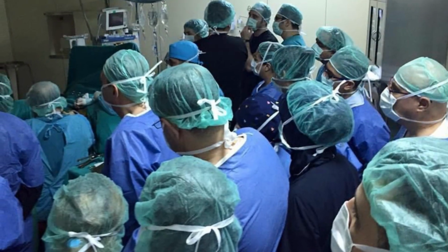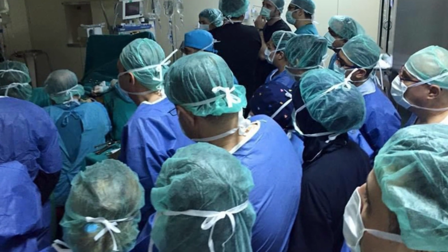Now I stopped because I realized there was a beeping sound of the heart rate going down, 60, 40. The heart rate went down to 14. There was panic in the operating room. The anesthetist immediately recognized it was air embolism, so immediately put the head down and gave hyperbaric oxygen, and our hearts were pounding very strongly because the heart rate of the patient was going down, down, down. Imminent arrest was averted because of the immediate management by the anesthetist. Again, head down, hyperbaric oxygen, and everybody in the operating room was standing on their toes.